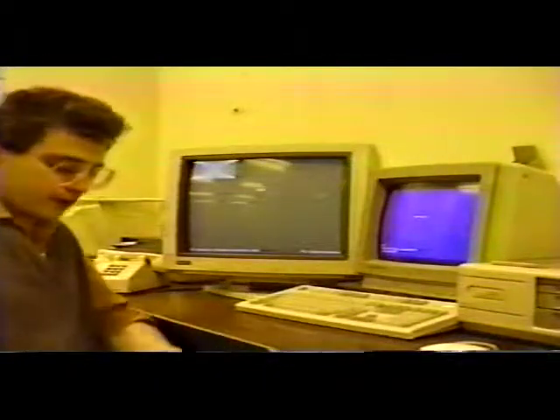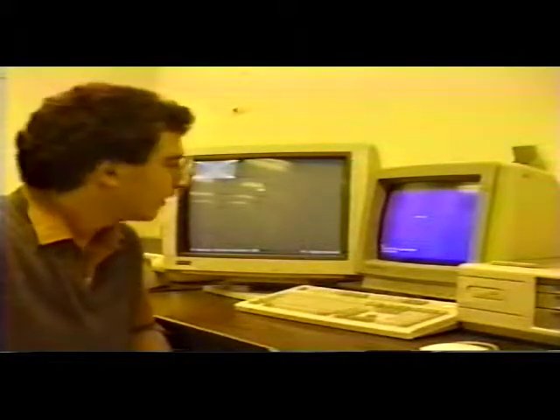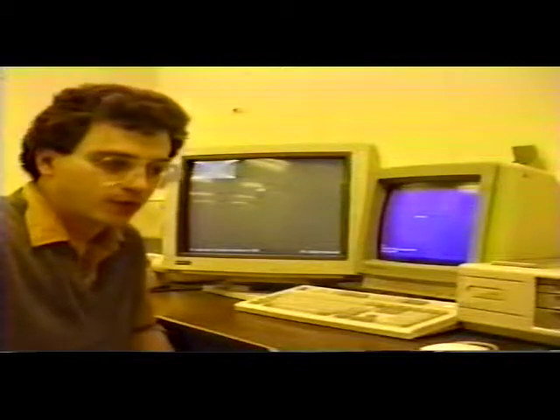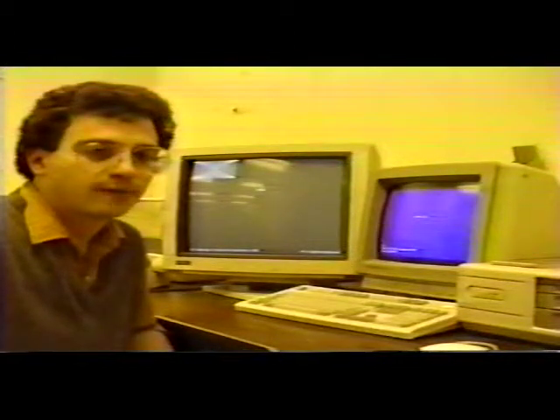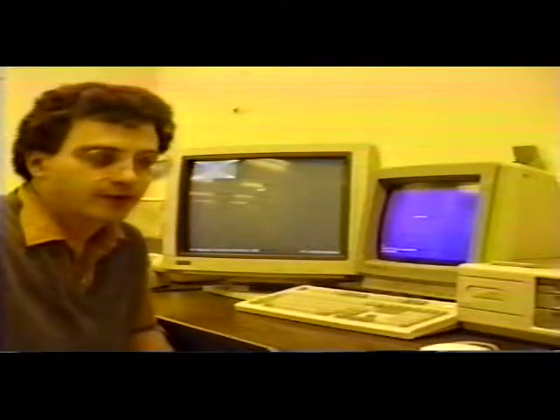Hi. My name is Simson Garfinkel. I'm a consultant here at Polaroid Research Labs, and for the next 10 minutes or so, I'm going to tell you about a project that I've been working on for the past 7 months. The project is to build an application program that uses optical recording technology to store medical information on optical discs or optical cards, such as this one. It's part of the IRIS project.